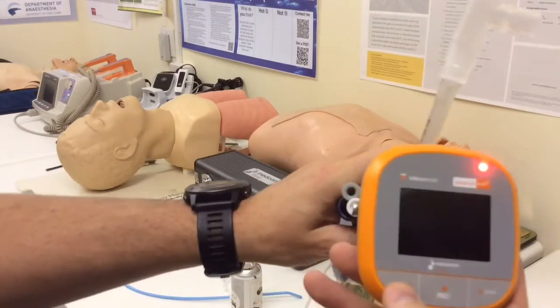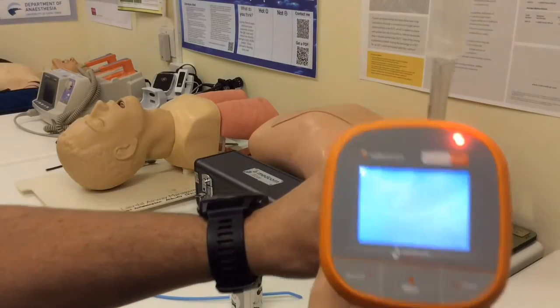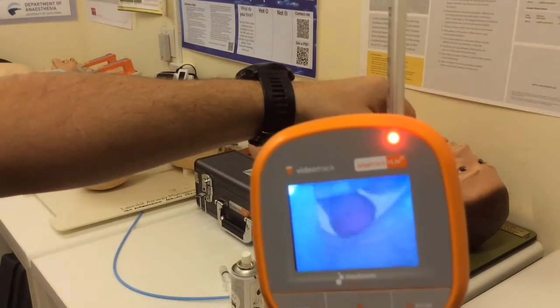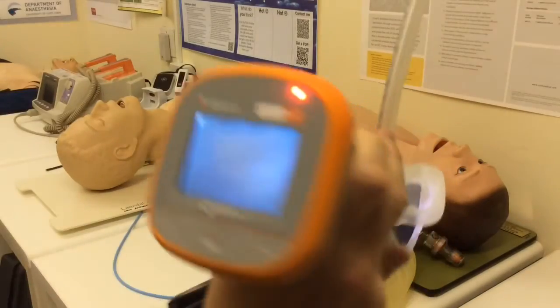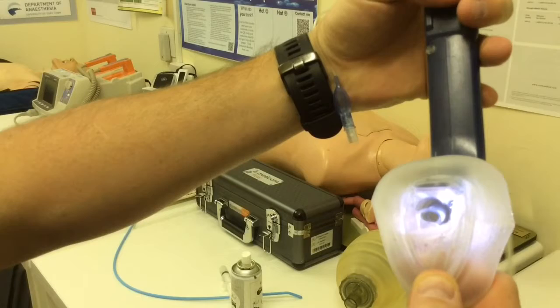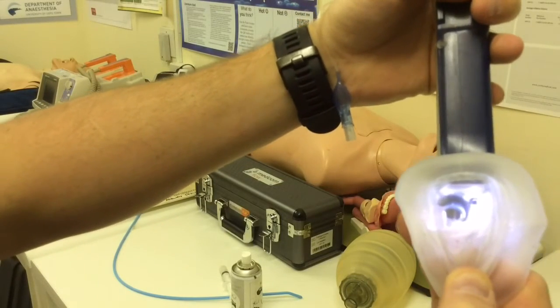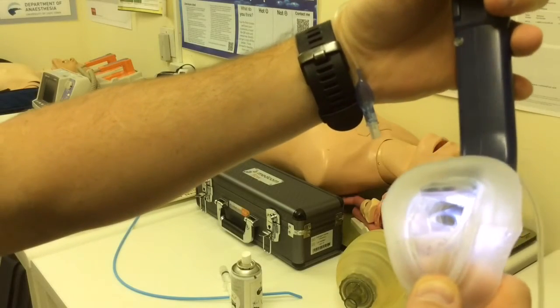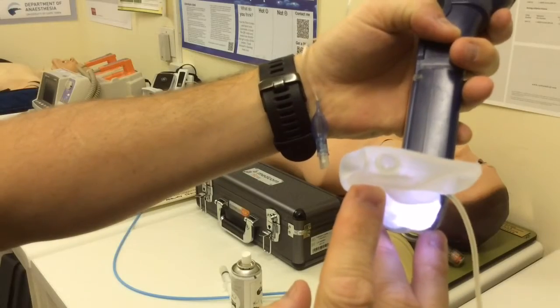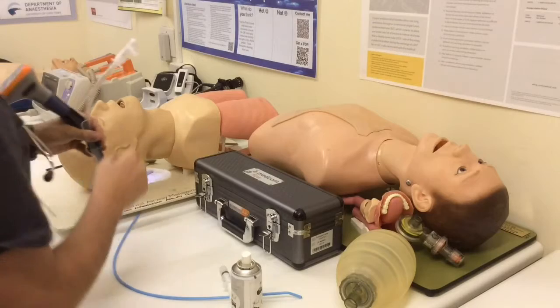And then you'll see that the camera head shows me a red light which says, okay, we're booting up, we're ready to go. And when I switch it on, I get a view through the device and I can see what's happening in the bowl of the device just underneath this little laryngoscopic blade. So there, in the bowl, if I bend it down a bit, you can see the end of the camera coming out in its little enclosure, as well as the light source and the drainage tube there for my supraglottic drainage. And there on the tip of the device is the drainage for the nasogastric tube to go through. Right, so this is now prepped and ready to use.